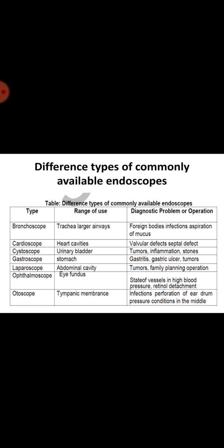Modern endoscopes are sometimes fitted with sensitive lights that use narrowband imaging, and this type of imaging uses specific blue and green wavelengths that allow the doctor to spot conditions more easily. An endoscopy is typically performed while the patient is conscious, although sometimes the patient will receive local anesthetic. Often the patient is sedated, and for endoscopy procedures involving entry through the mouth, a guard will be used to protect the teeth and lips as the tube is inserted.